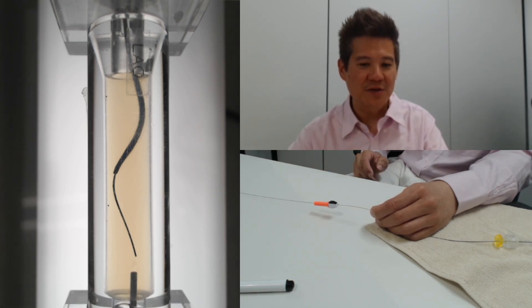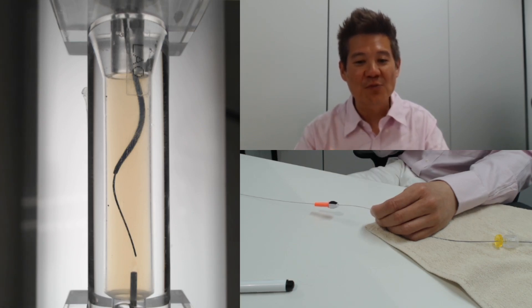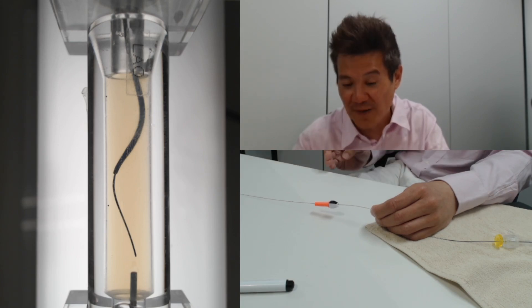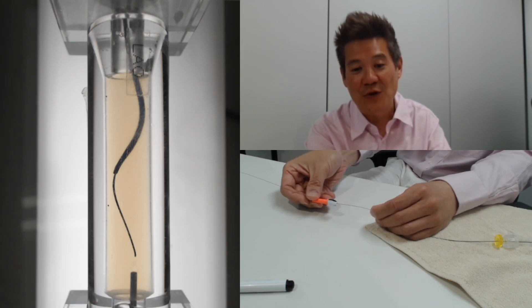Actually, it's not quite slap bang in the middle, it's slightly on the right hand side, so we want to rotate this wire a little bit towards the target, but a very small amount. Maybe only one or two degrees like that. But we need to go back to the third view, the original view to wire, because we always wire from the view that's furthest.